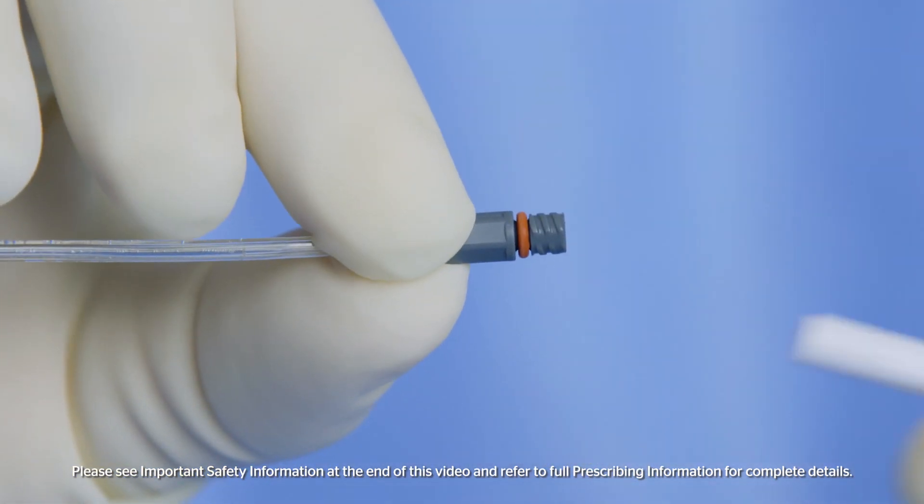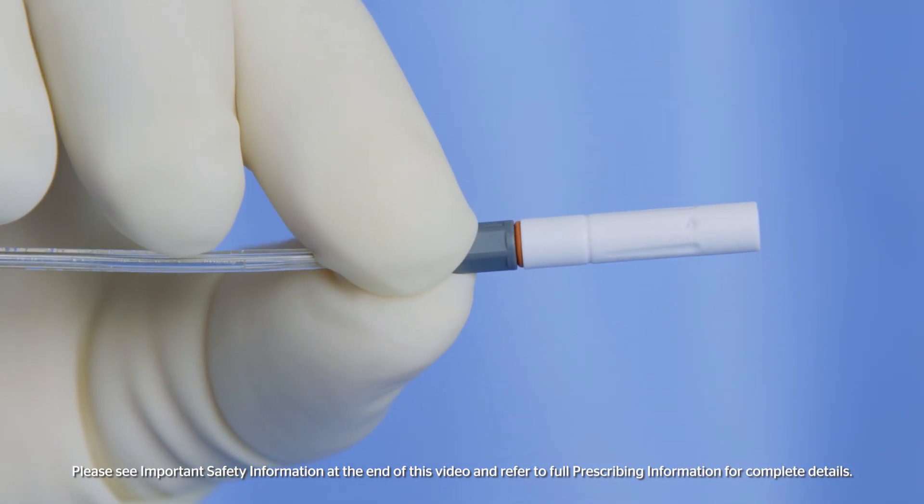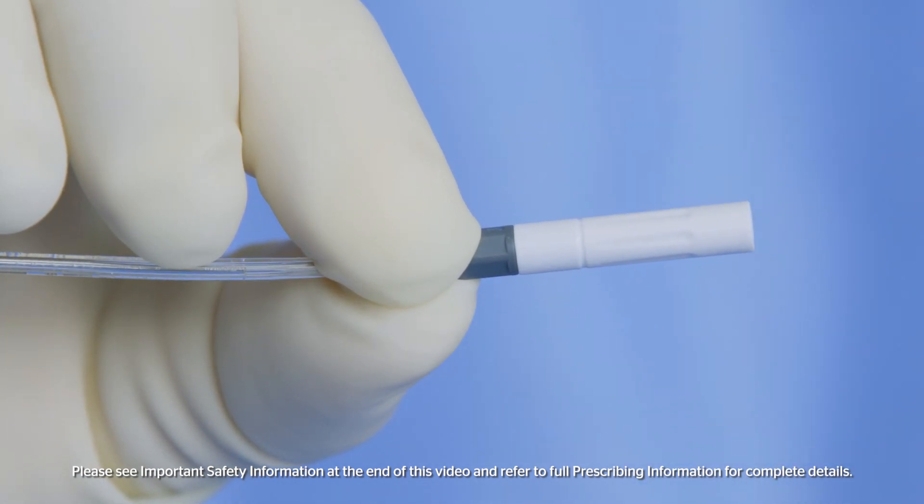Connect the airless spray tip by twisting clockwise. Ensure it is securely tightened before use. The red O-ring indicator will not be visible if the airless spray accessory is securely tightened.